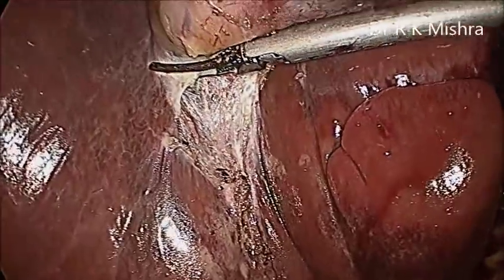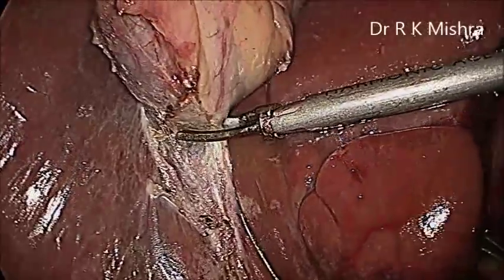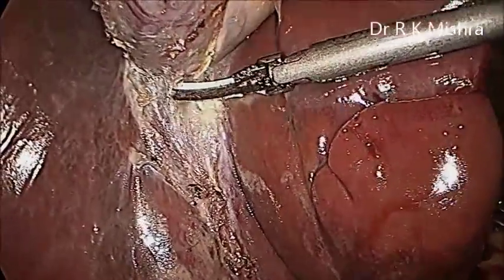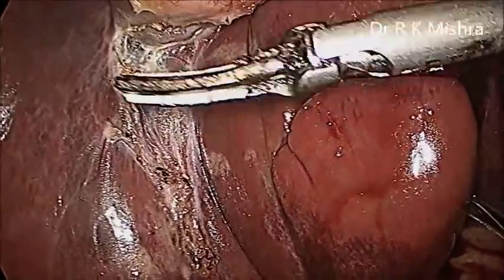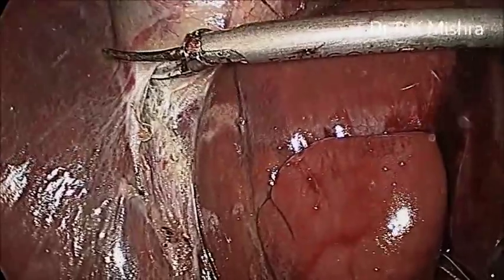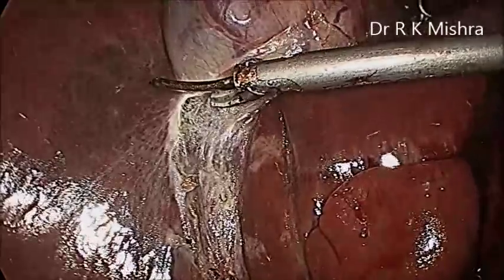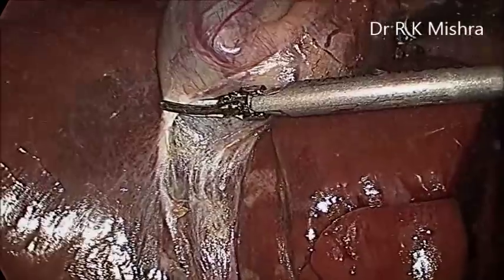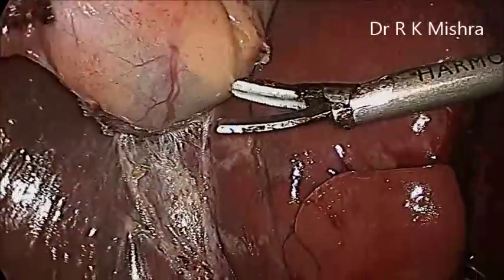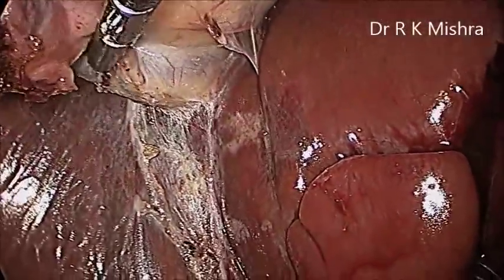and this is now anteromedial traction, where the neck, this is anterolateral traction. A good areolar plane has to be ideally maintained. If you are too near to the gallbladder, then there will be a chance of perforation. And if you are too near to the liver, there may be a little bleeding. We should take care that when you are dissecting and reaching towards the fundus, the assistant who is giving the traction over the fundus should be careful not to penetrate into the diaphragm.